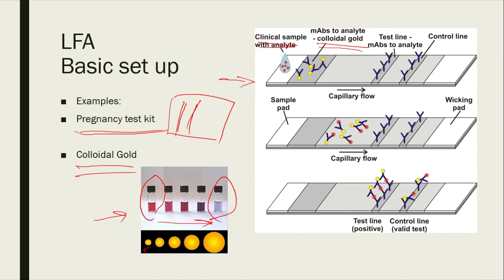And then following the collecting site, there is a pad that has things ready set, coded on there initially. Now sample is the only thing you put in there. Everything else is being coated on this nitrocellulose. You can think of it as like high grade coffee filters, perhaps, some type of material, being coated on there already.